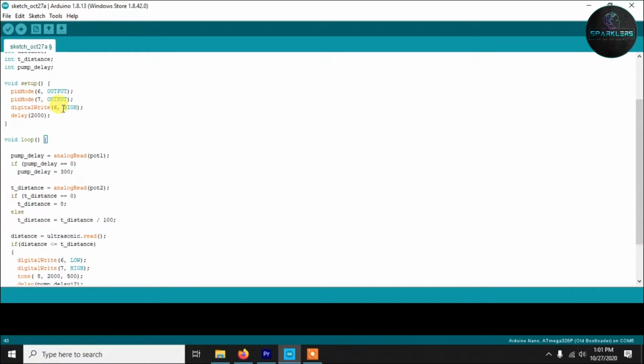Now in my relay, if I make the pin high, it will disconnect those two pins, the middle pin and the right pin. And if I make it low, it will connect those two pins, the middle pin and the right pin. So that's why initially the pump should be off. That's why I have made this pin high, so it will turn the pump off. From the very beginning the pump will be off, and whenever we need it, we will turn it on by making pin number 6 low. Okay, so I hope you know how a relay works. In that case you will easily understand this.